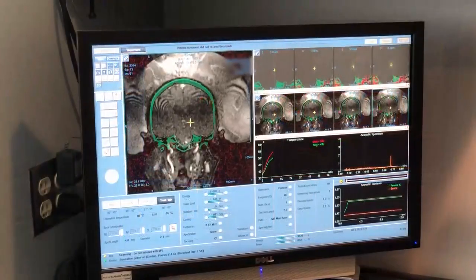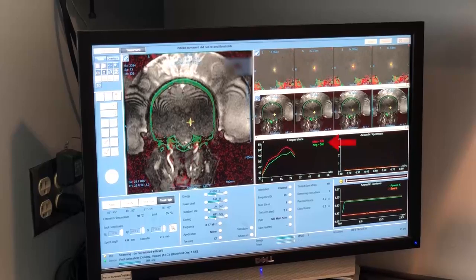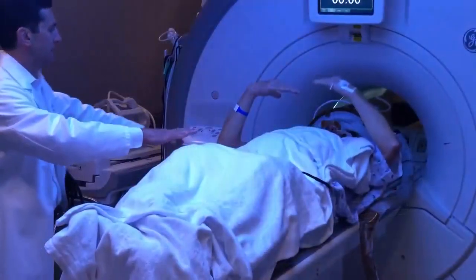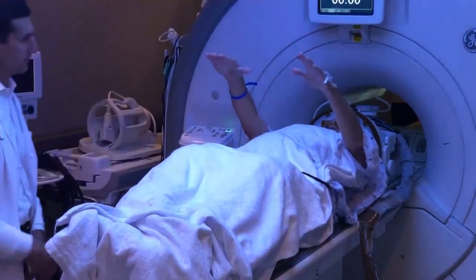Once the heating pattern has been verified to the proper location and clinical target, the acoustic energy is increased to temperatures necessary for a therapeutic ablation. The temperature graph depicts the peak voxel temperature in red and its average temperature with the immediately adjacent voxels in green. The patient may be clinically assessed at any point during the procedure. The procedure is ended when a satisfactory result has been achieved.